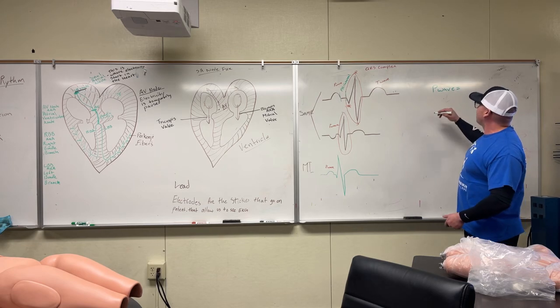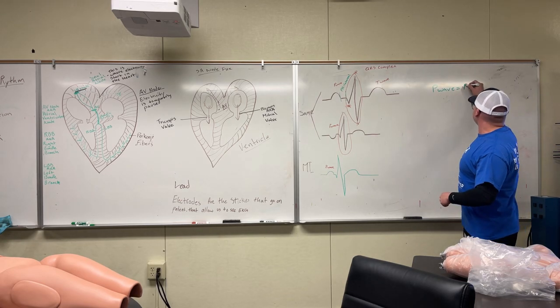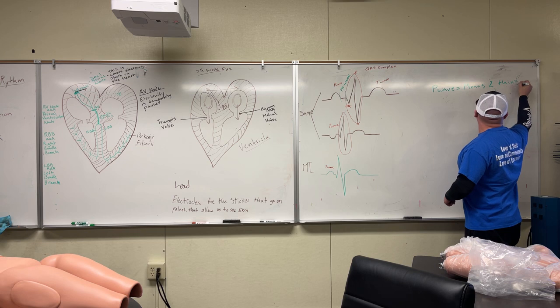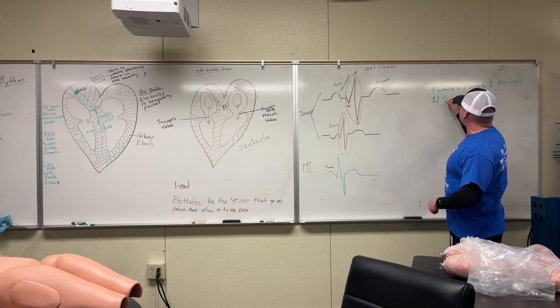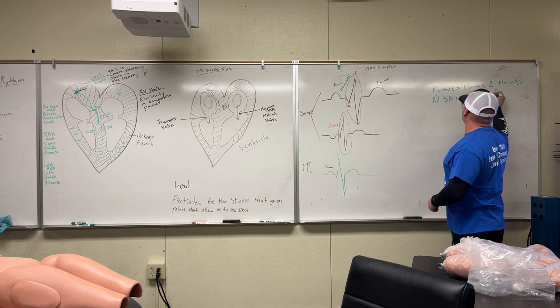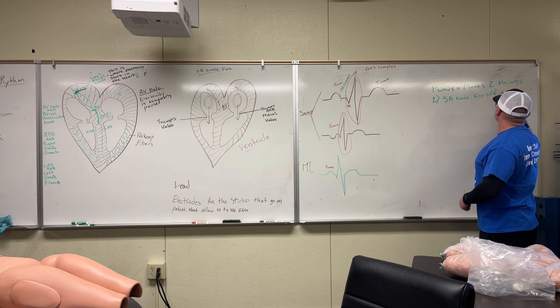All right, so P wave means two things. I'll put it here, means two things. One, SA node, sinoatrial node, fired off. I'm gonna keep it super simple. Fired off successfully.